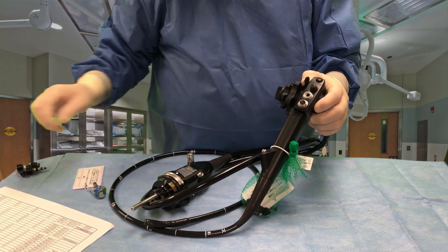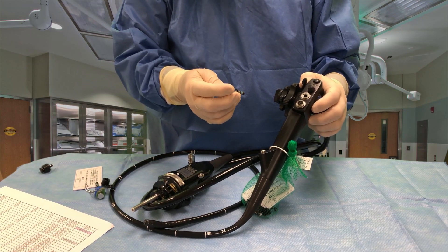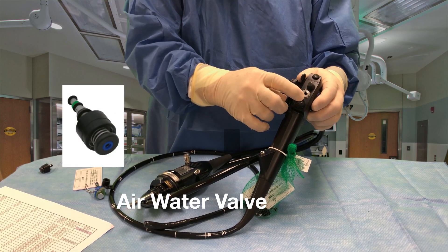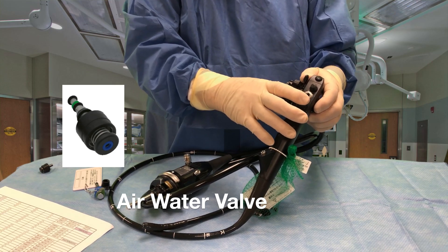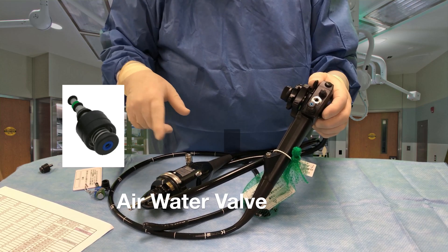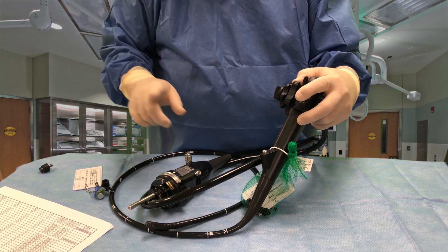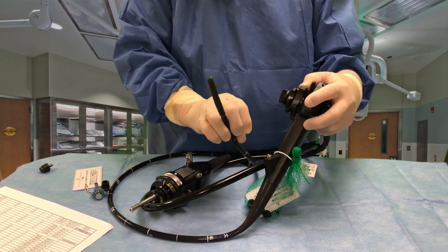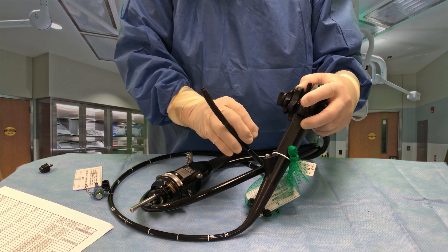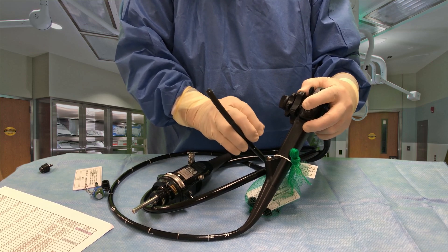You'll notice the ports here, just like the other scopes — these ports hold different valves. This valve, for example, is the air-water valve. Notice it's got a blue end on it. If I just put my finger over it during use, while we're pumping CO2 through the scope instead of air, that allows a nozzle on the end of the distal tip to insufflate the lumen or organ that we're trying to visualize.